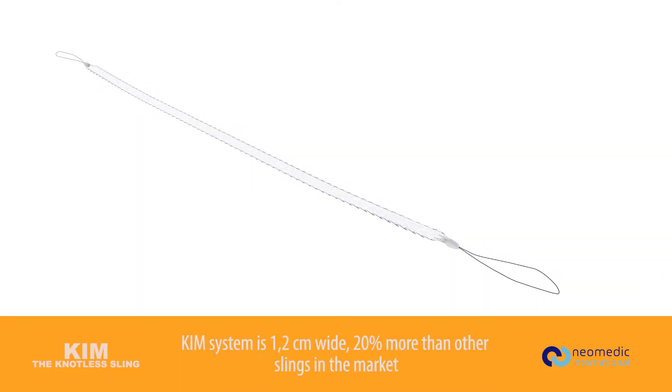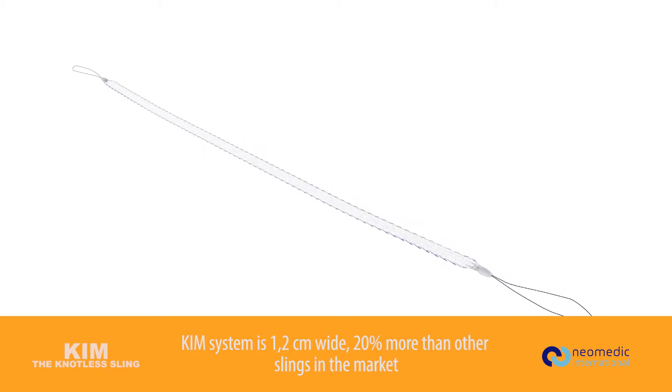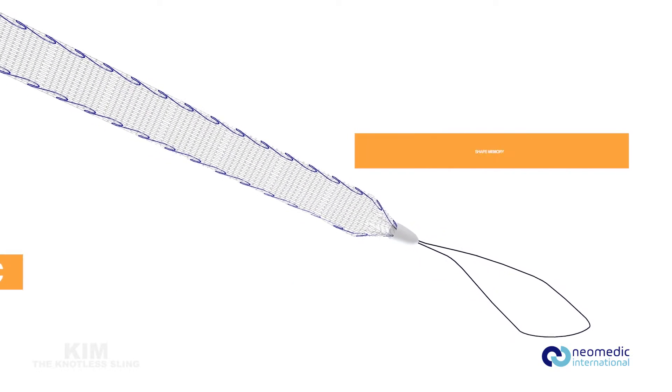Kim's system is 1.2 centimeters wide, 20% more than other slings in the market. Macro rigid, microelastic, shape memory.